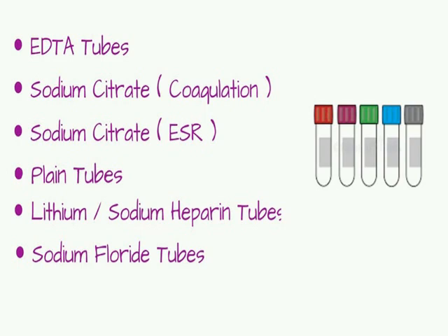EDTA tube, sodium citrate for coagulation, sodium citrate for erythrocyte sedimentation rate, plain tubes, lithium sodium heparin tubes, sodium fluoride tubes, and I think I'm missing a U in fluoride, sadly in real life too. Anyway, let's say a patient comes in and he requires different kinds of tests that require different tubes.